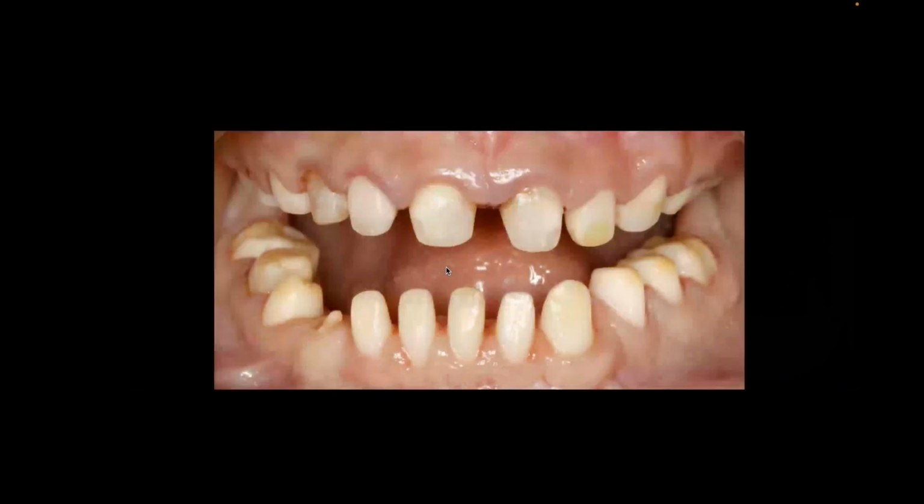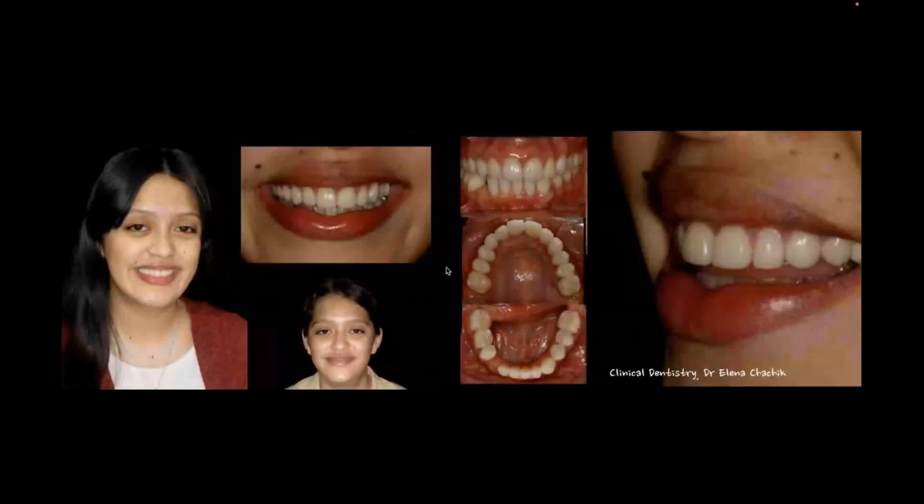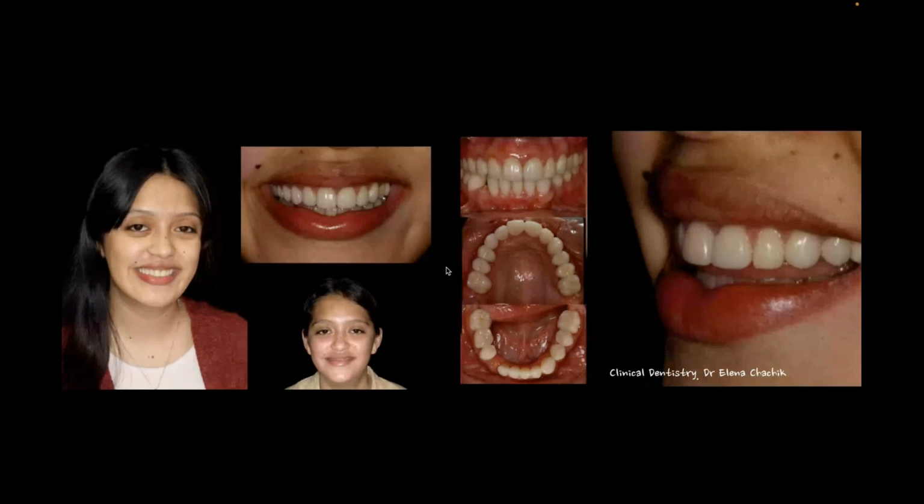And in a case like this, an amelogenesis type case, I can utilize this on a young girl who was only, I think, 15 at the time. She still has a lot of growing and a lot of augmentation to do. So we want to use this as a long-term solution. And this is where I really like the nano hybrids. I do a lot of them for younger patients, especially when they broke their teeth or they have some issues.